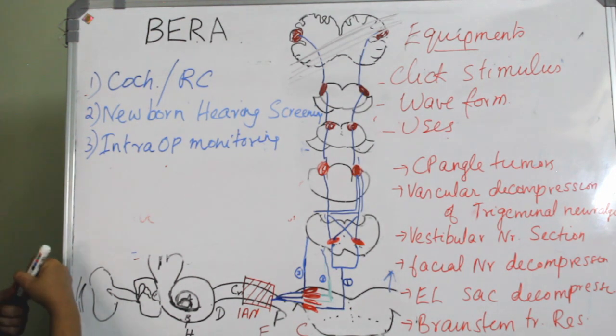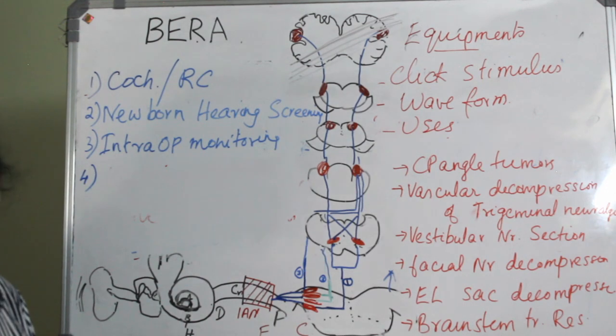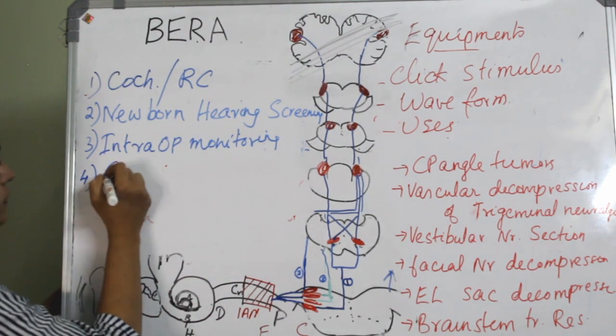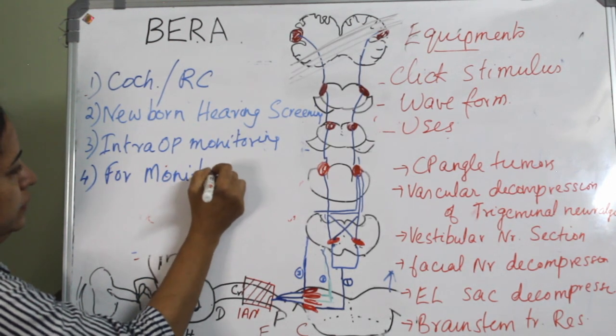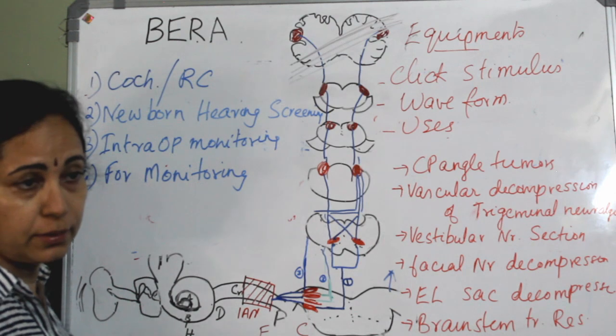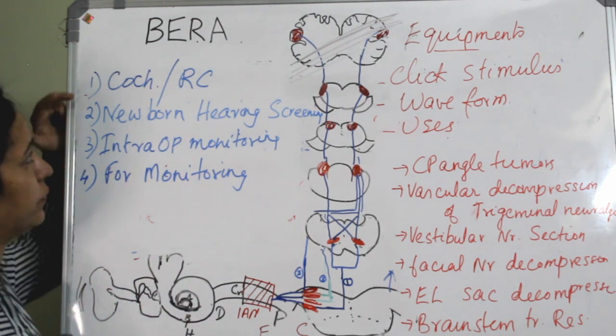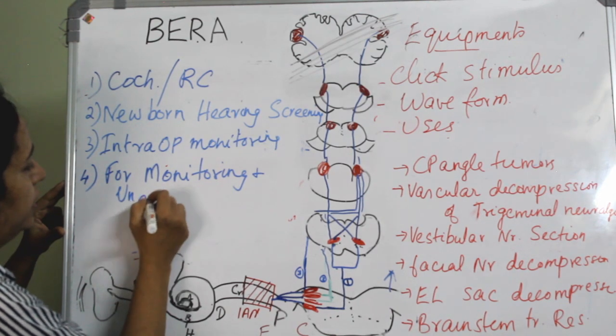And the next is monitoring and understanding of tinnitus. This is beyond the usual advantages or uses of BERA. Monitoring and understanding tinnitus.